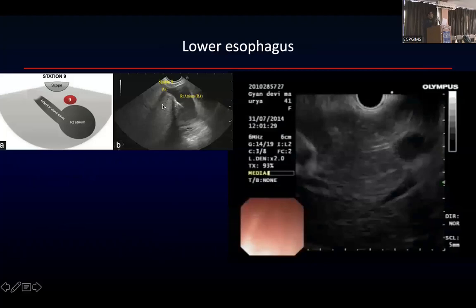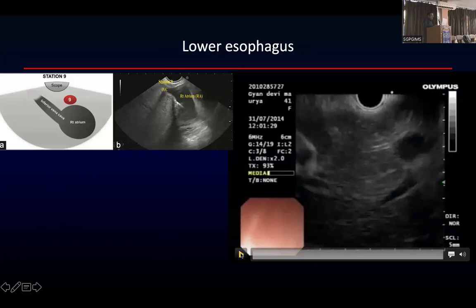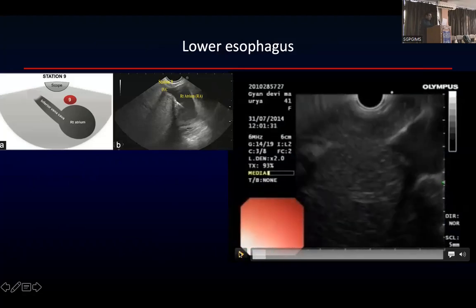So if you place your scope at the GE junction, see the intrahepatic portion of the IVC, trace the IVC to the right atrium. The area that you see adjacent to the probe is station 9. Is that clear? That is station 9. So this is the video. If you see this, this is the intrahepatic portion of the IVC. This is a hepatic vein.